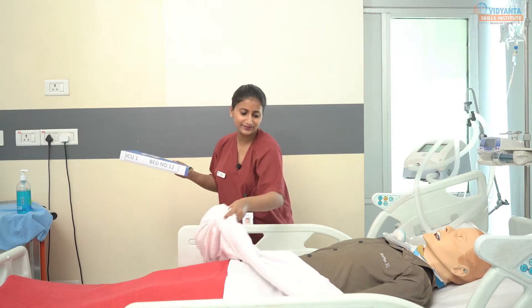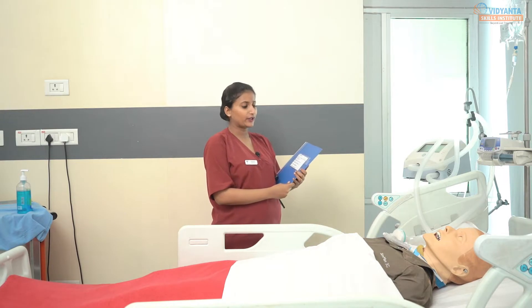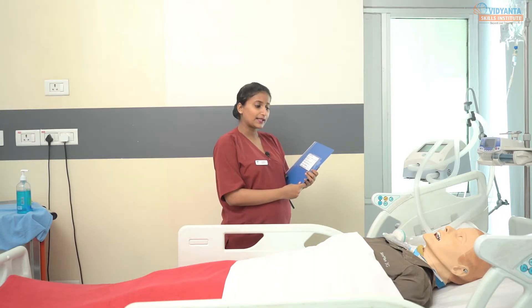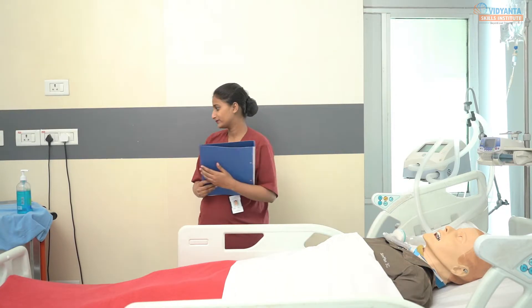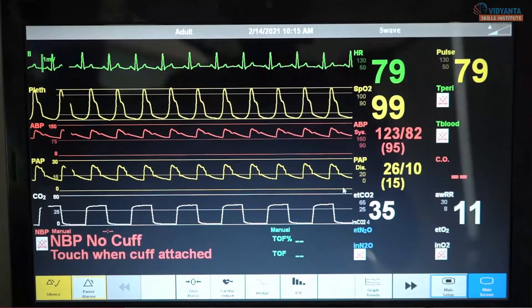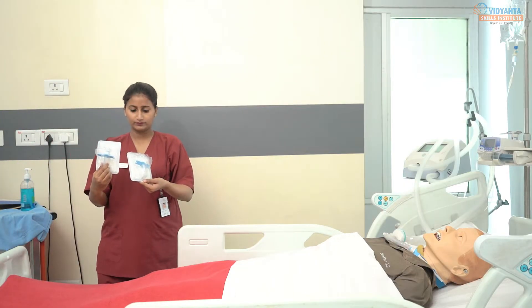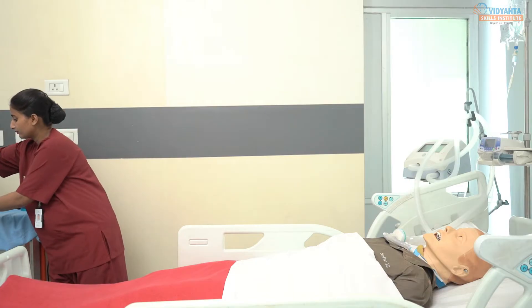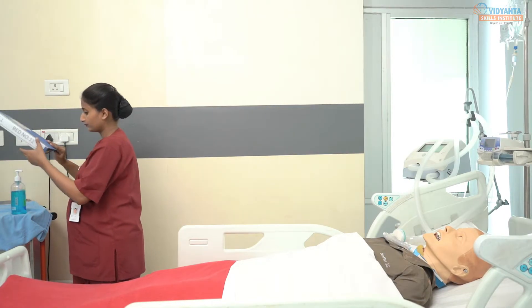"Sir, I need to provide the tracheostomy site cleaning to prevent you from infection. I will prepare my articles and will come back within a few minutes." Check the vital parameters and also verify that two new tracheostomy tubes are present at the patient's bedside — one of the same size and another of a smaller size to be used in case of any emergency.